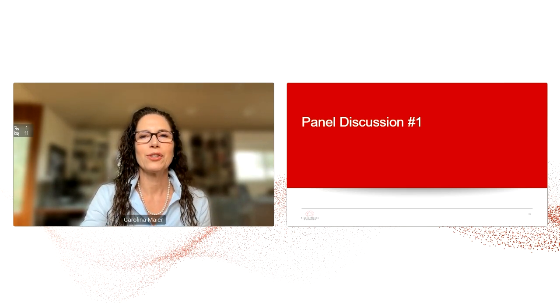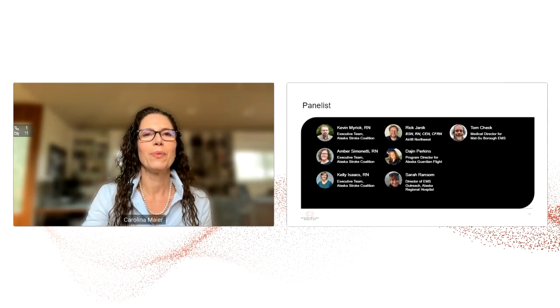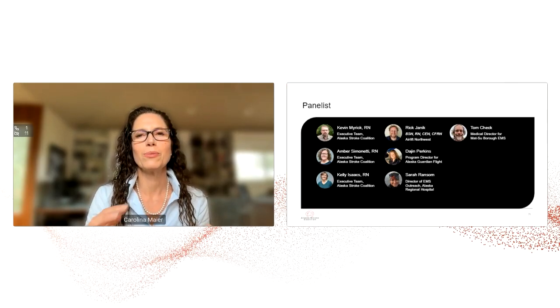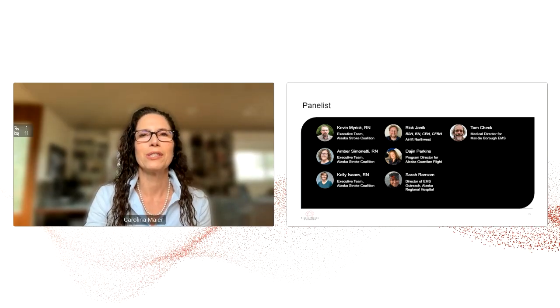And I'd like to have an opportunity here to introduce our panelists once again. We will explore some stroke cases. We're going to focus on the nuances of interpreting the imaging and determining the crucial next steps for that patient. And to lead us through this complex scenario, I'd like to introduce, again, as I said, our esteemed panelists.